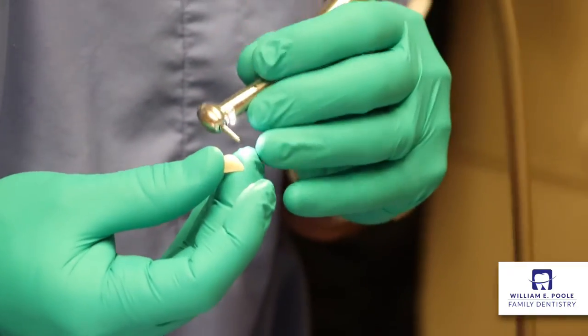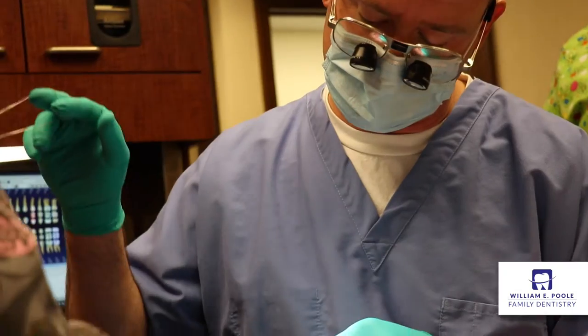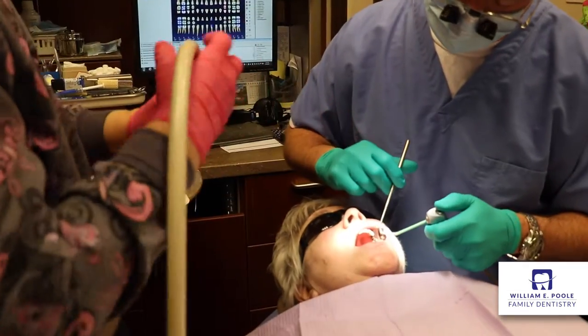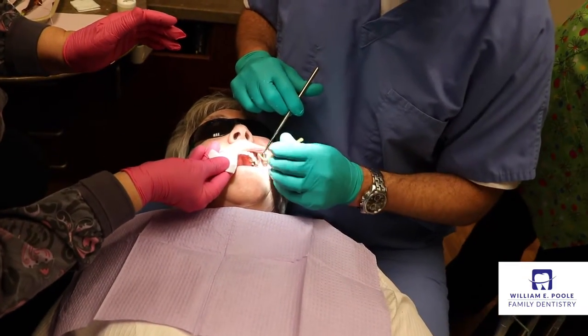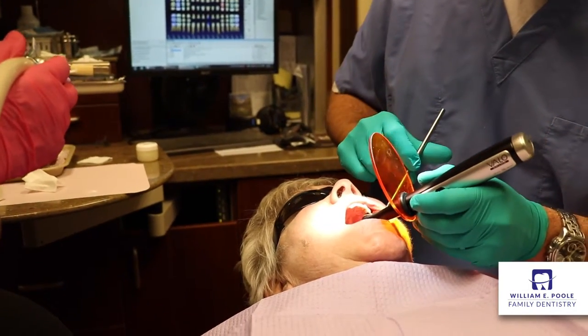After the crown is tried in to the mouth and all of the specifications are checked, we prepare the tooth for the bonding procedure, which is basically to dry the tooth, place a bonding agent over the tooth. We scrub it into the tooth to prevent sensitivity, and then we harden the bonding agent with a light that has a specific wavelength.